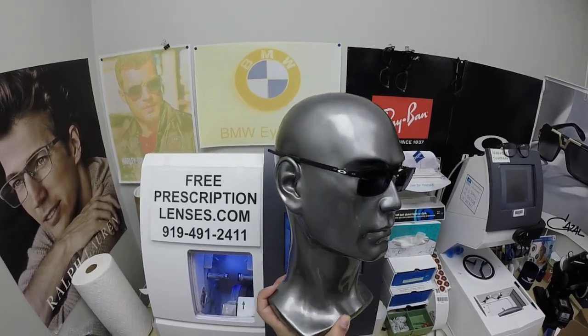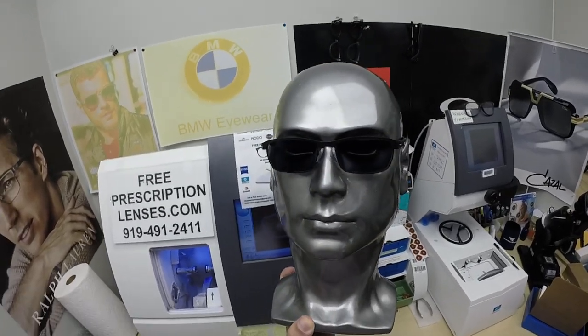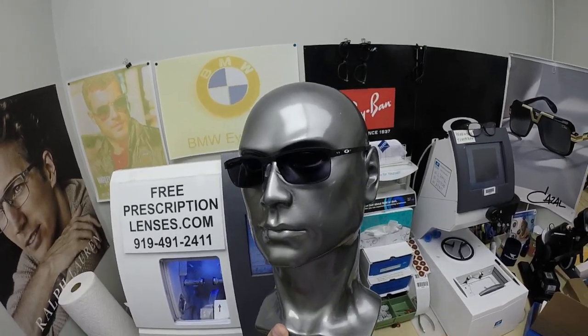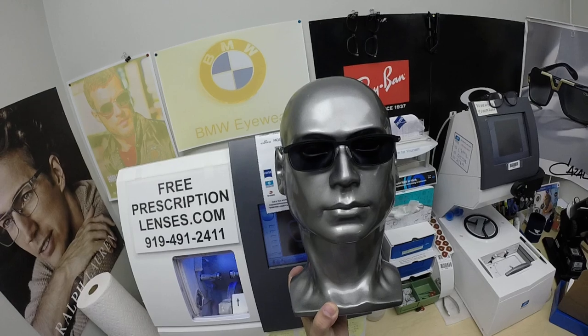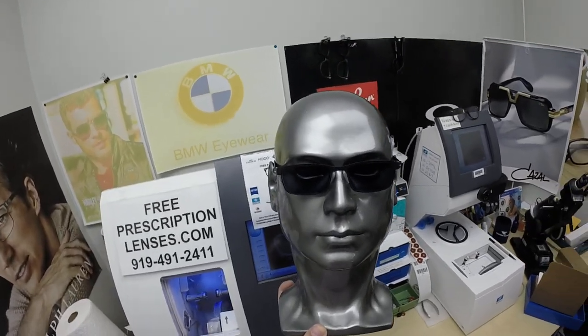All photochromic lenses are also temperature sensitive, meaning they will get darker when it's 85 degrees and below than they will when it's 95 and above. But I remind everyone: when it's 100 degrees outside you're miserable, they're miserable — nobody and nothing works 100% when it's 100 degrees outside. We all work much better when it cools off.